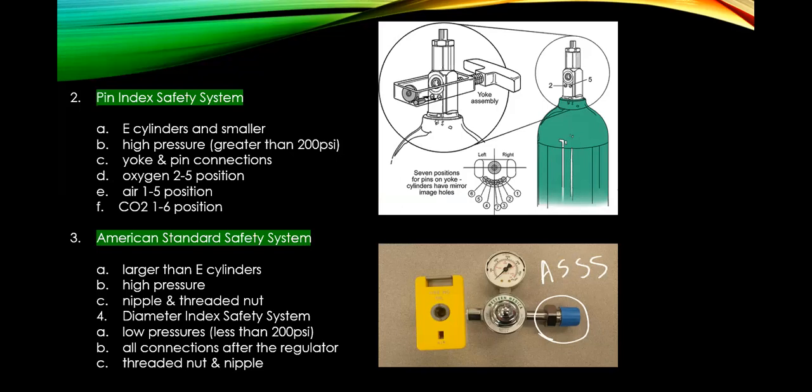So your nasal cannula will hook up to your DISS. Your high flow aerosol face mask, aerosol T-piece, aerosol face tent, all of those things we set up, they screw into the flow meter at the DISS, okay?